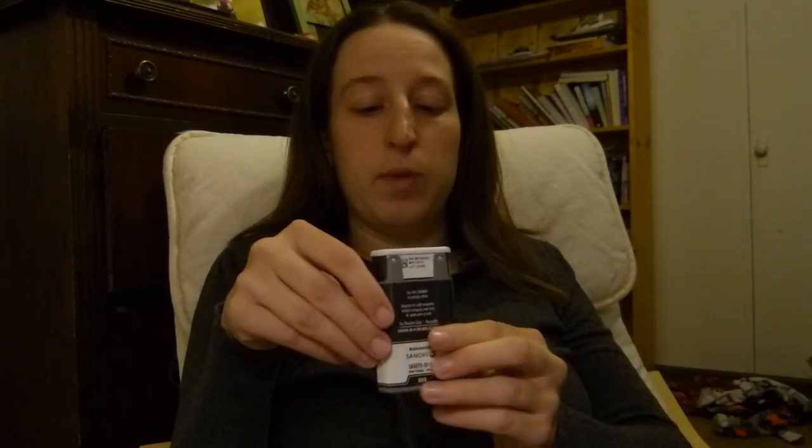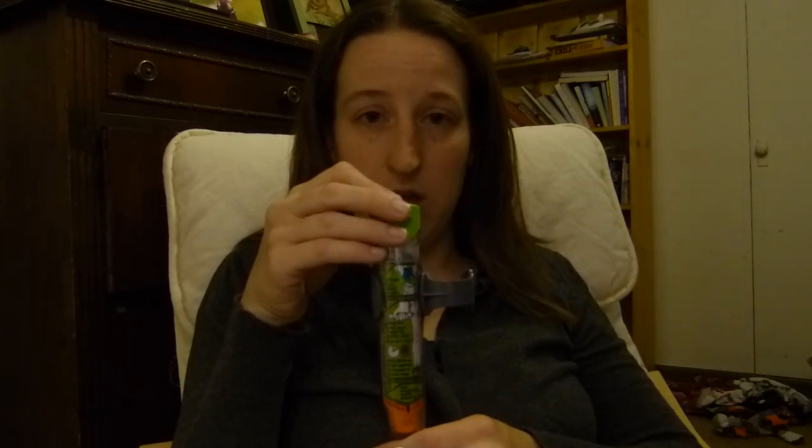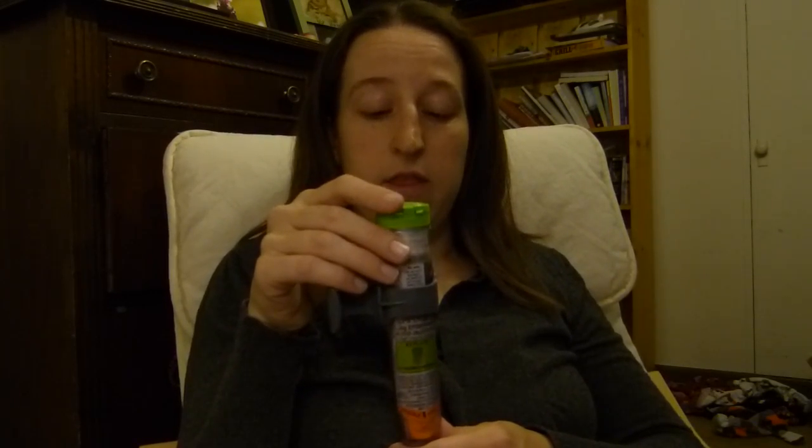I cannot wait for us to have one of our own, because these things, seriously, I'm afraid I would inject myself. And John was actually saying that there are a lot of people who do inject themselves with these ones because of the way they're designed. That is what the drug rep told him, is that a lot of people accidentally inject themselves in their thumb when they're supposed to be injecting their friend. And that is not what you want to do, obviously, when you're trying to save somebody from an allergic reaction.